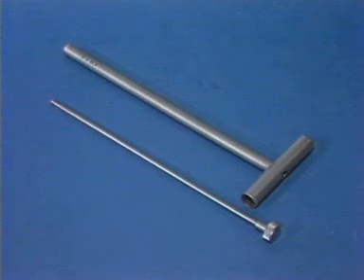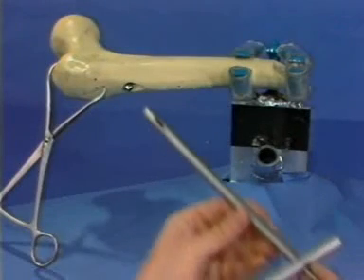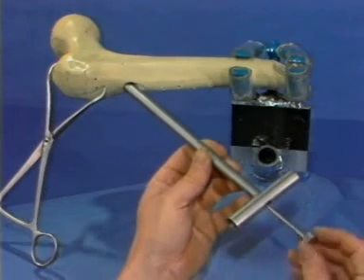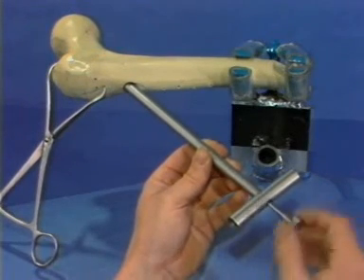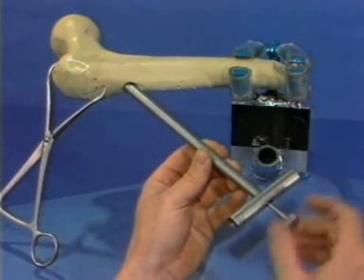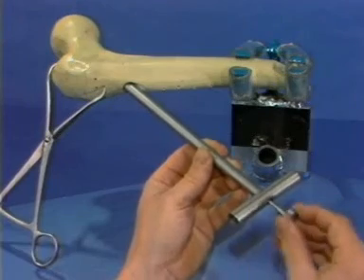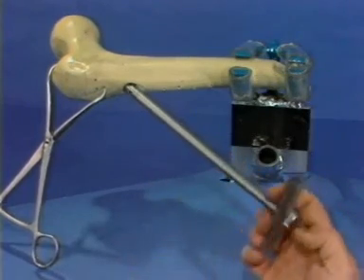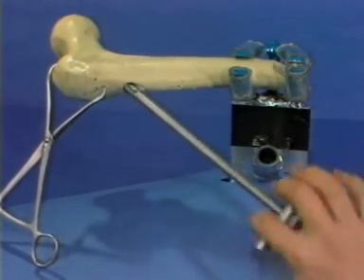The long coupling screw for DHS removal and DHS wrench are now selected. The wrench is placed over the DHS screw, and then the coupling screw is attached. The DHS leg screw can then be removed without difficulty.